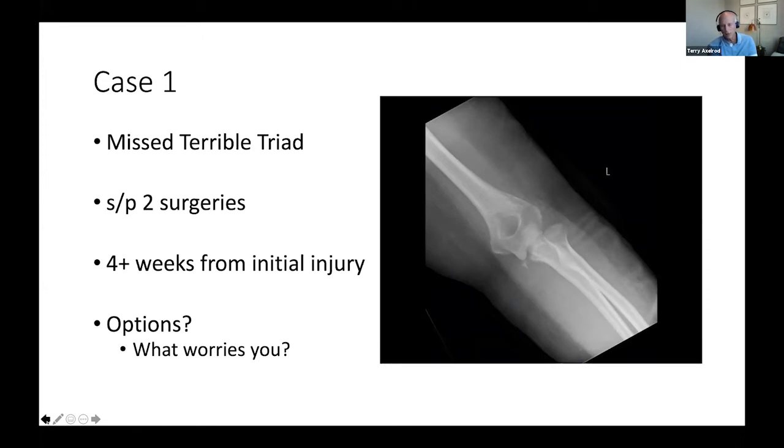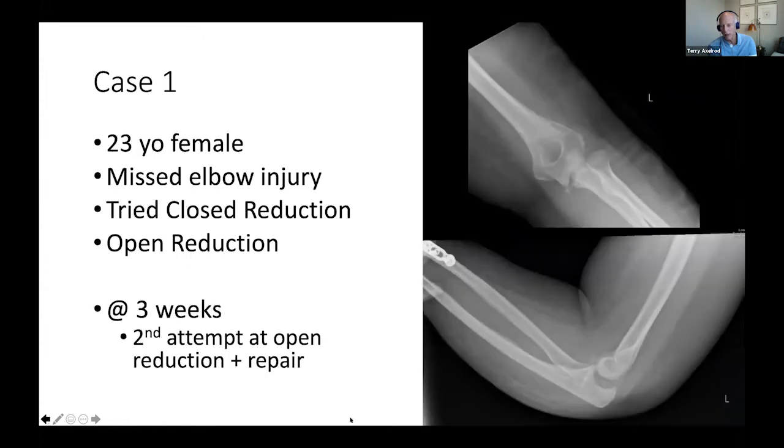And I think we can see it on the lateral x-ray. And again, a CT scan would really help with that. But the radial head's been eroding up against the capitellum there for a few weeks. And that makes a situation where, even when you're doing your open reduction and you're going to do your ligament repair, et cetera, you're going to have a bony defect, which is like taking out a radial head, only it's on the capitellar side. So it's going to increase the instability.